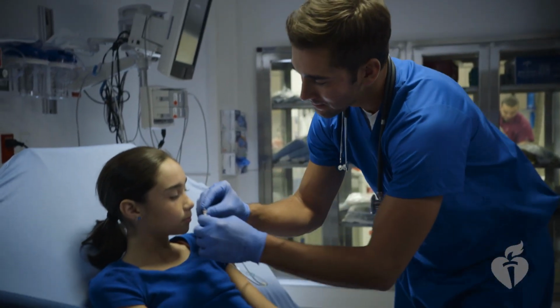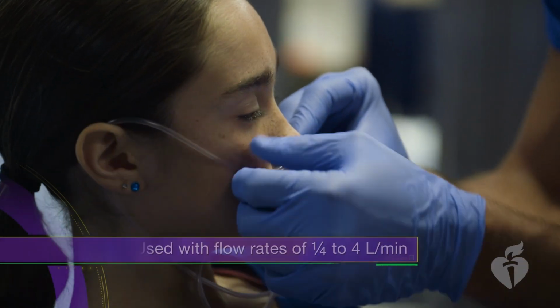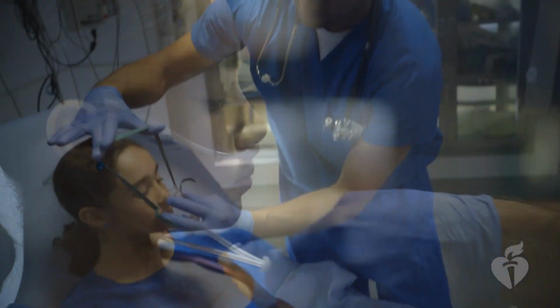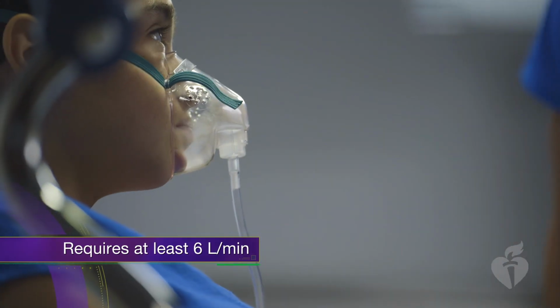The oxygen concentration delivered by these systems is determined by the oxygen flow rate, the child's breathing volume, and the child's respiratory rate. With low-flow systems, the lower the oxygen flow, the lower the inspired oxygen concentration. Examples include simple nasal cannula and simple masks. A simple nasal cannula is generally used with flow rates of 1/4 to 4 liters per minute. A simple oxygen mask requires at least 6 liters per minute, but 6 to 10 liters is generally provided.